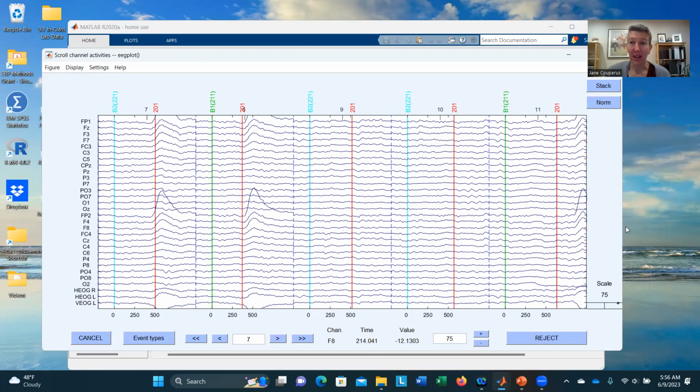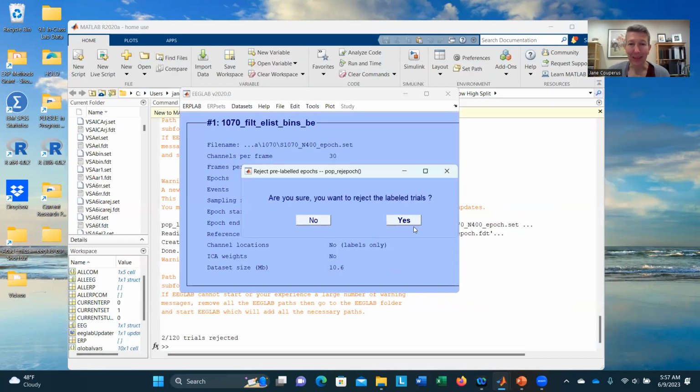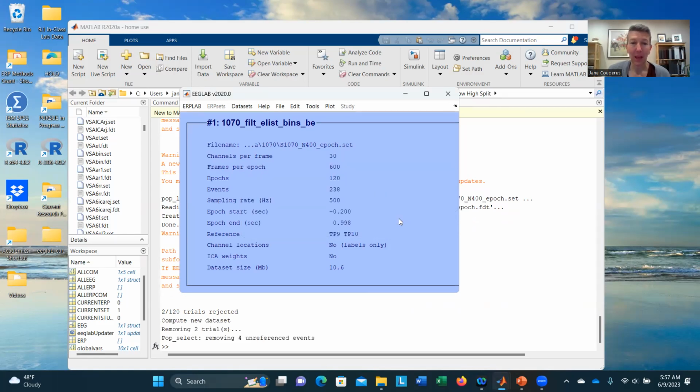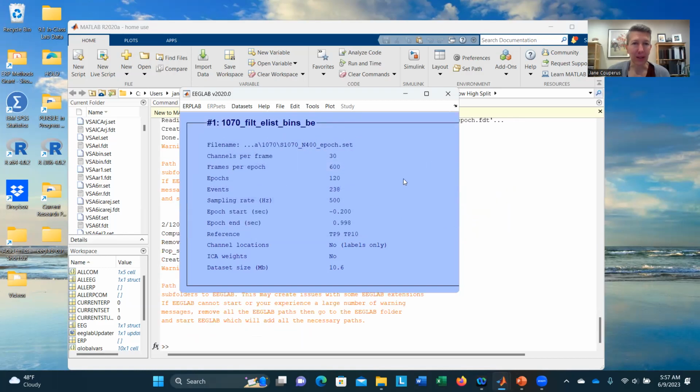Once I've gone through and I've decided which are the ones I care about, I'm going to go ahead and hit reject. And it will ask me, do you want to reject the label trials? I'm going to go ahead and say yes. What it's doing is it's marking those trials and saying those are artifacts. When you do this particular kind of rejection, it's going to ask you if you want to save it. I definitely would. Generally, I'm not going to today just for the purposes of this video, but you would want to save this as something on your desktop to have it. No, go ahead and click OK. It creates a second data set.